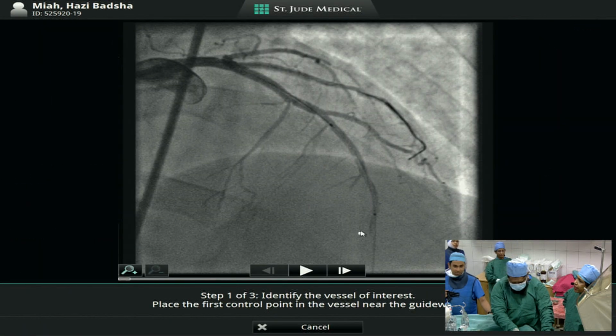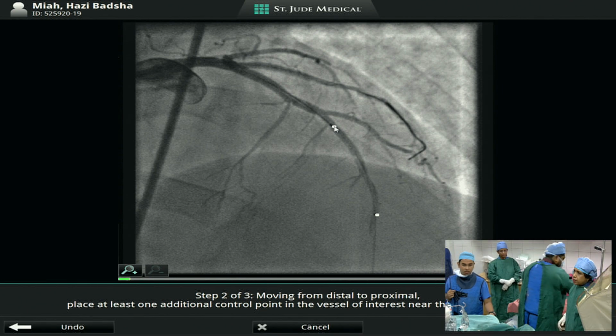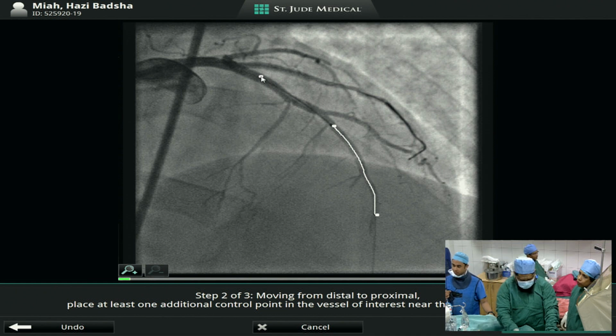So we are done, right? You want to show us the final runs, please? Okay. And do we want any more shots from here, or we are finished? Just let's have a look at the OCT.